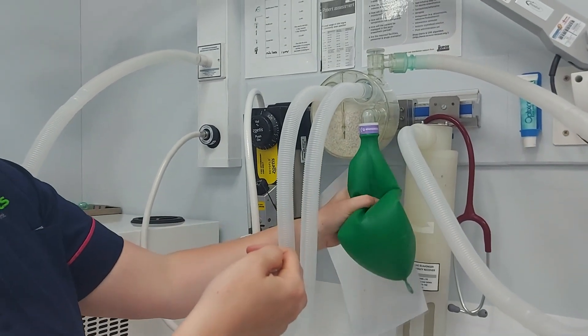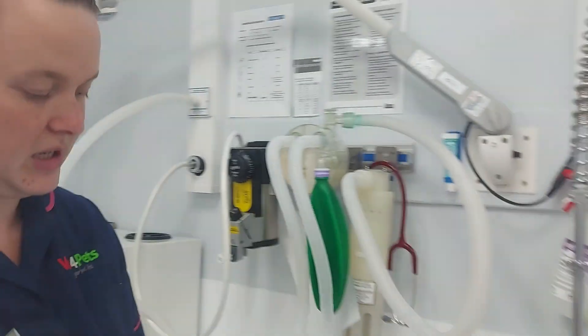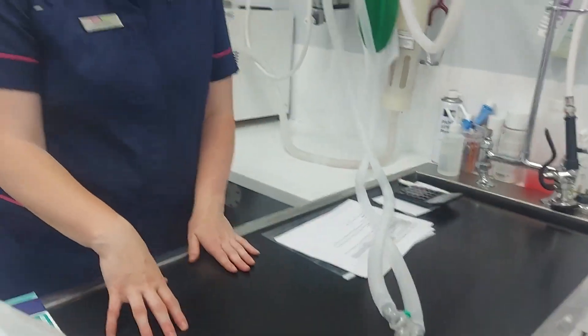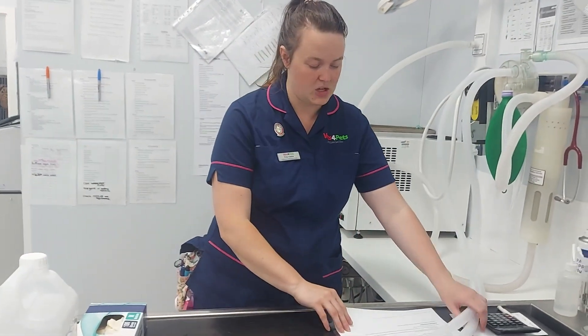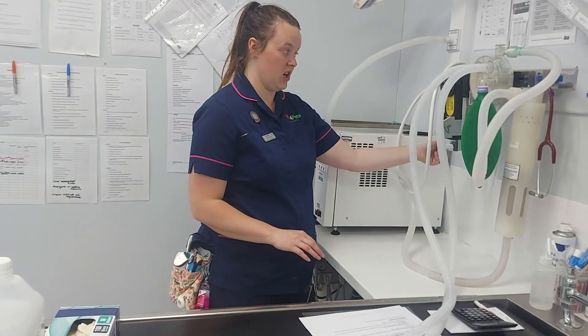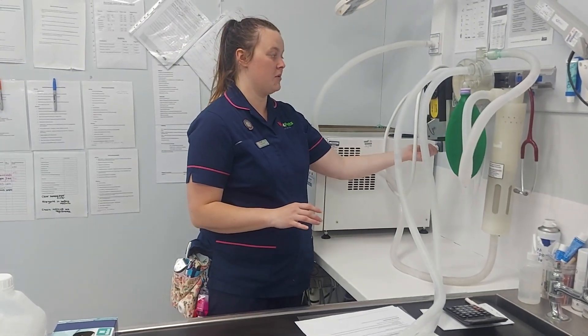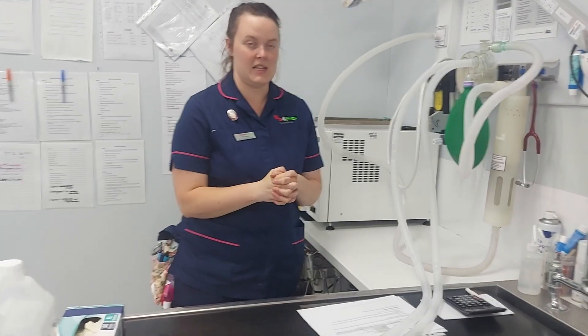Empty the bag and then remove my thumb from the circuit, so that circuit is ready to use. You will have a chart in front of you with body weights to the left and flow rates to the right. You choose 40 kilos, find the appropriate flow rate, and then set that on the anaesthetic machine. For example, if it's four, you turn your flow meter up to four, and advise the examiner that you have completed the task. Those are the slightly different steps, but that essentially is your circle and rebreathing system.